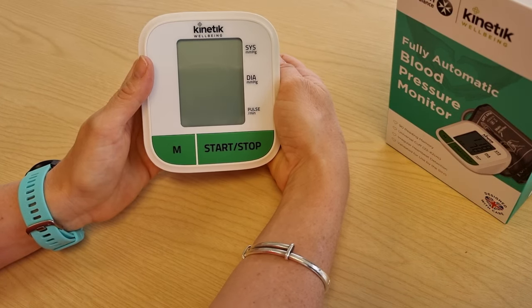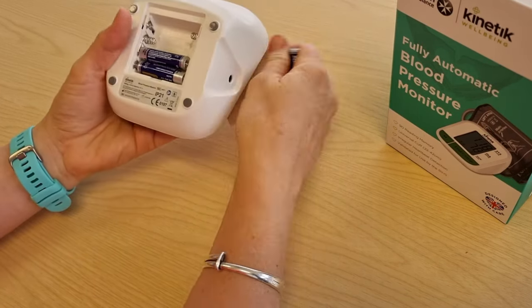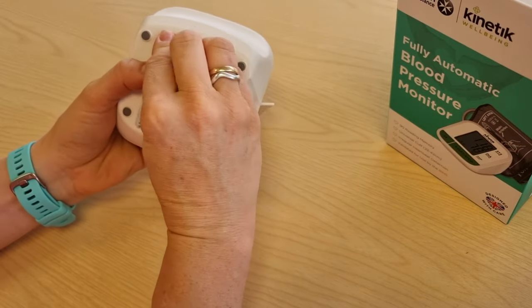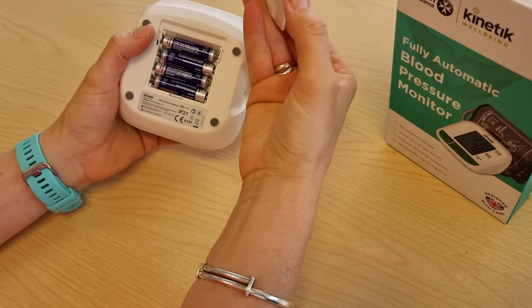How to set up your WVP1. Insert the batteries and the cover.